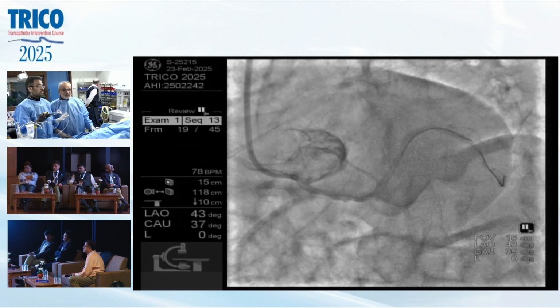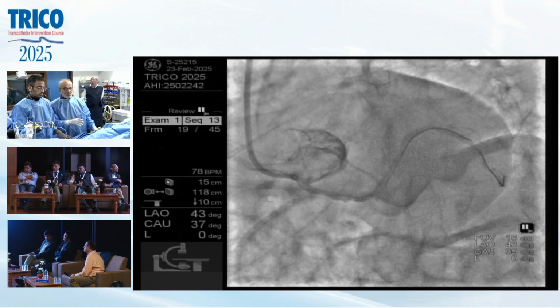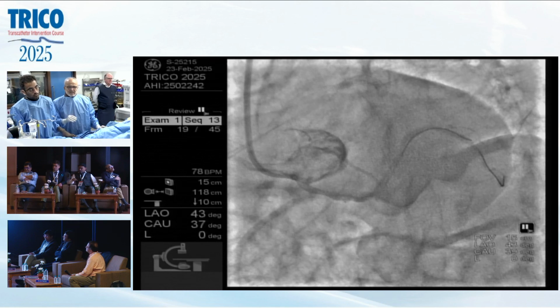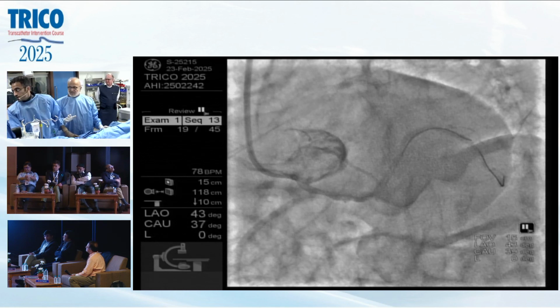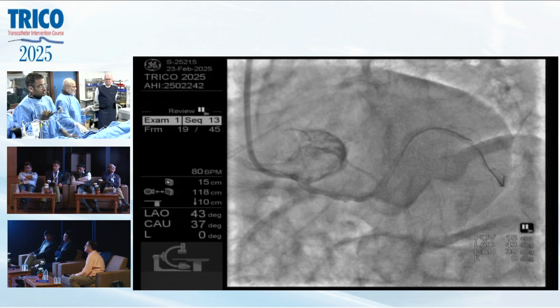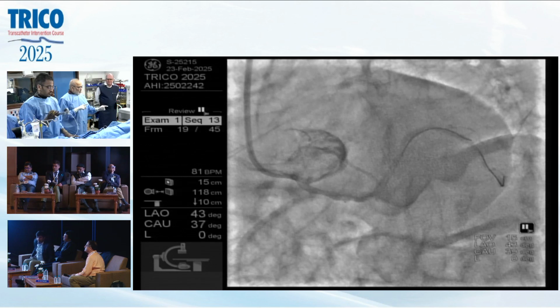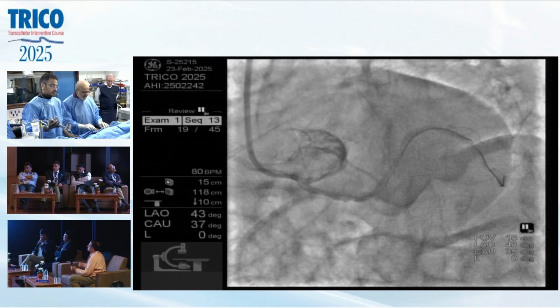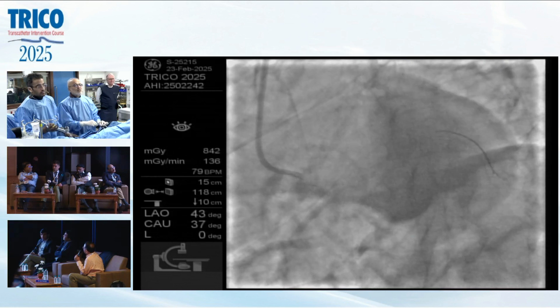If it is fat, the restenosis is highest, landing proximal or distal. If it is fibrosis or calcium, the restenosis is in a modest percentage, not very high. So if you are not getting a normal segment proximal and distal, then make sure that you don't deploy your stent in fat. If the stent is deployed in fat, however good the acute result may be, chances of restenosis will be very high. What is your comment on that? Absolutely. The lipidic landing is very suboptimal.